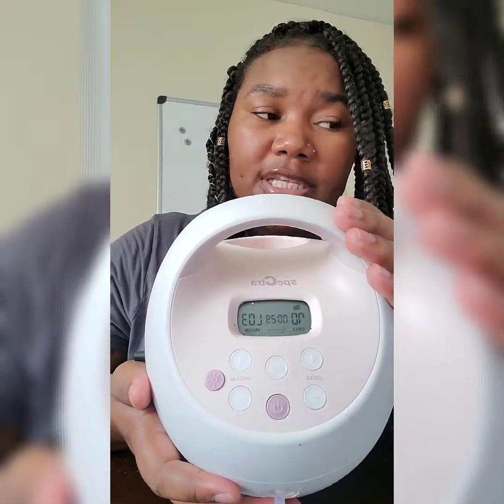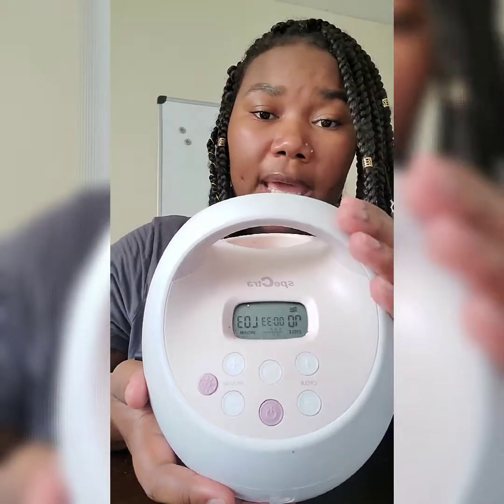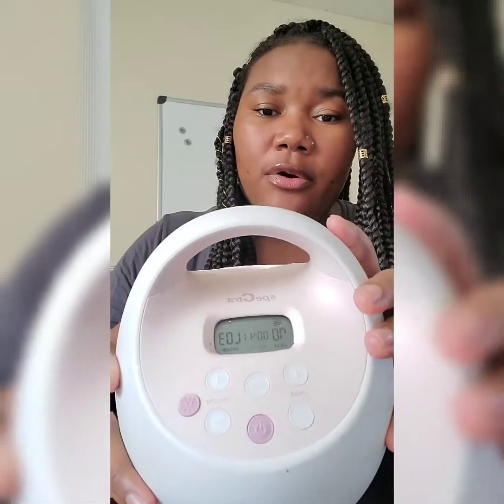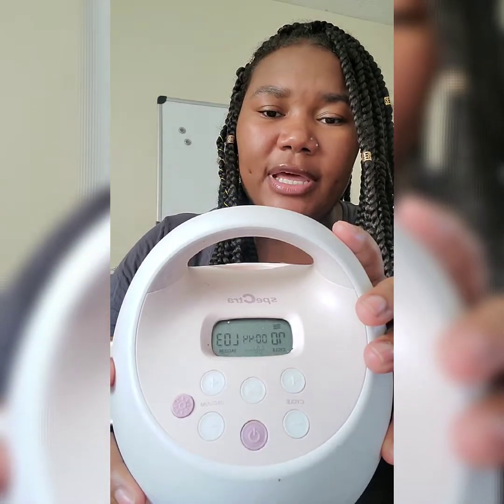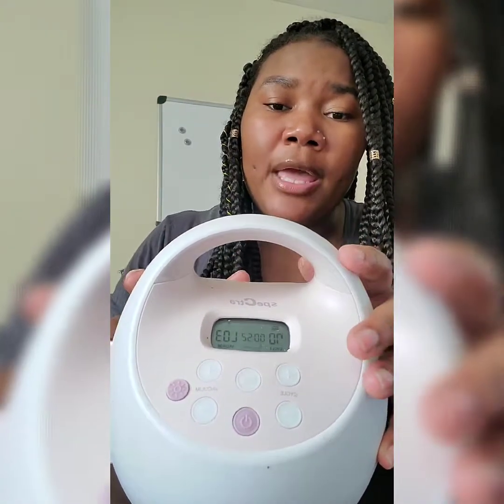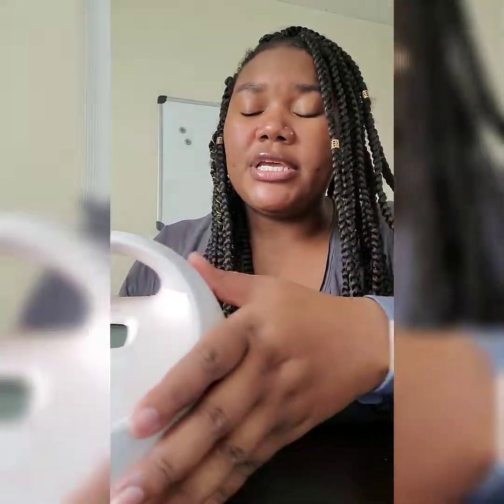Another thing I like is the timer feature. It's automatically set to a 30-minute timer, and I just leave it there because I feel like that's the most consistent session length. If you're going to use this machine, I do suggest getting one of those hands-free bras so you can get things done in that 30 minutes. Also make sure you massage your breasts, stay calm and relaxed, and drink a lot of water while breastfeeding.